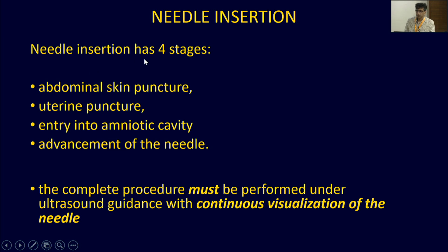Now the needle insertion has 4 stages: the abdominal skin puncture, the uterine puncture, the entry into the amniotic cavity, and advancement of the needle.